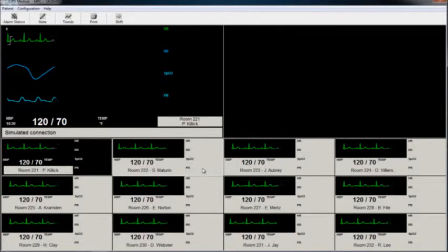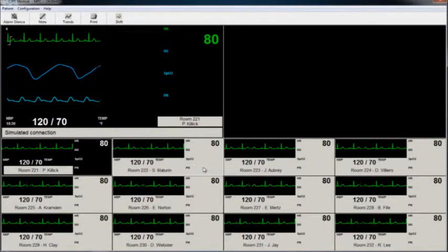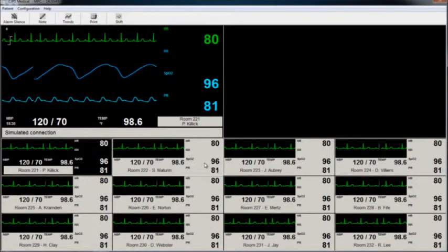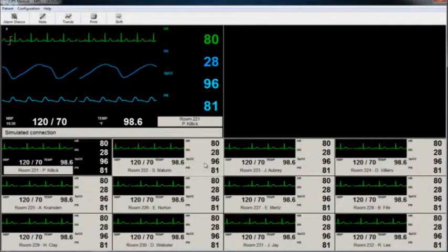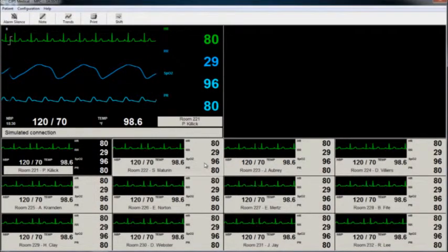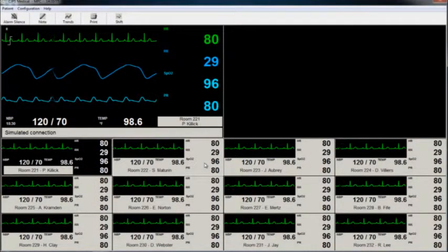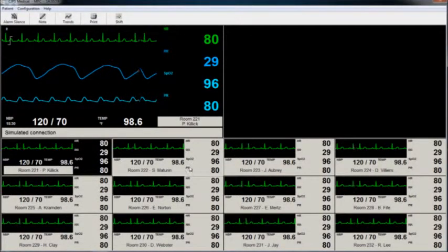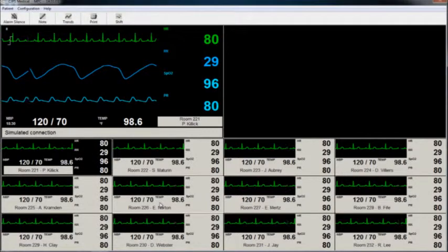The main NTS software screen allows the clinician to monitor multiple monitored patients, referred to as rooms. The software allows the viewing for up to 64 patients using the VitalPoint Pro. The main screen has a quick access toolbar for common functions, as well as 3 tabs for additional features.